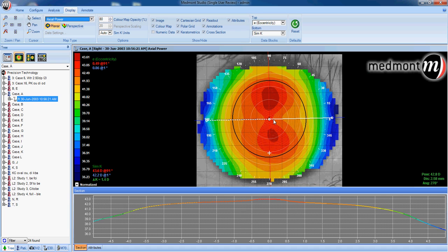Axial power is very helpful in understanding how the anterior surface of the eye may contribute to a patient's refraction and visual acuity. For instance, this patient has with-the-rule corneal astigmatism.